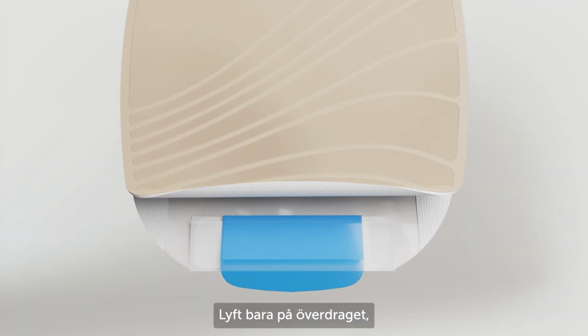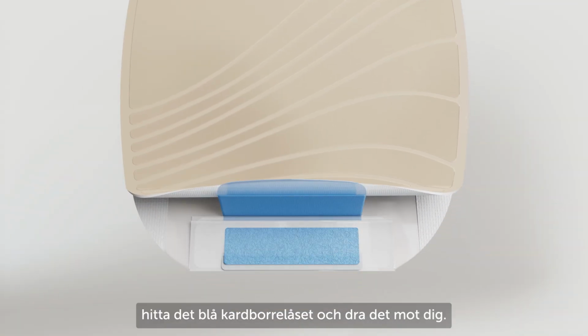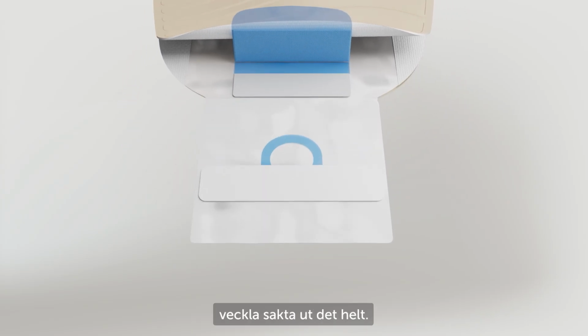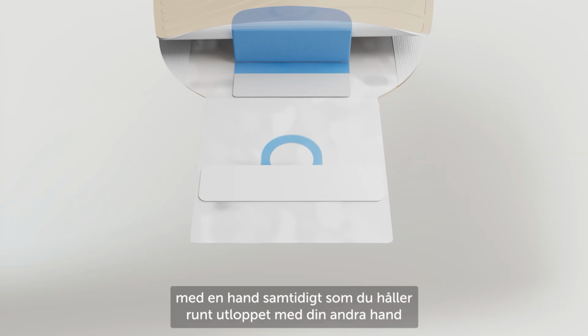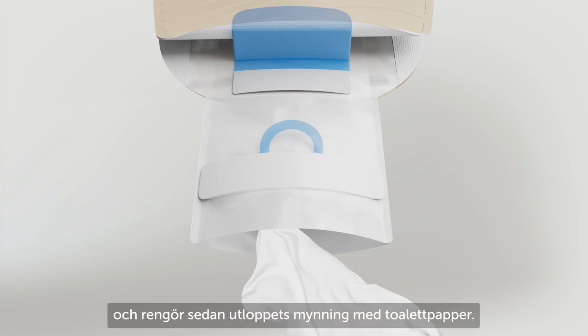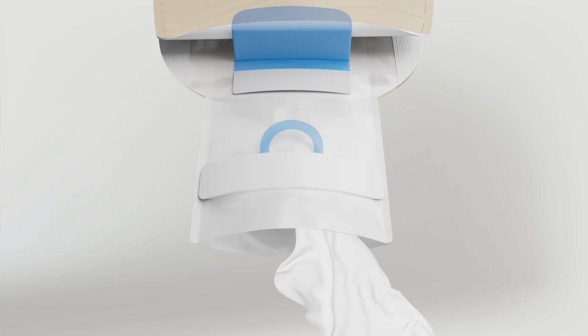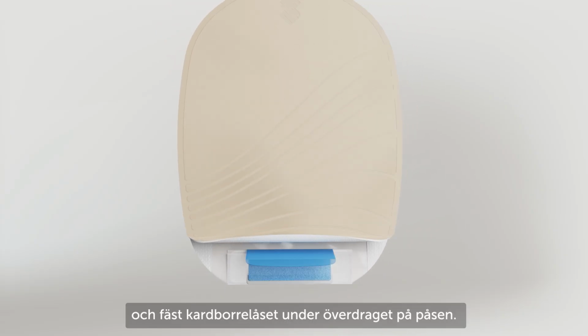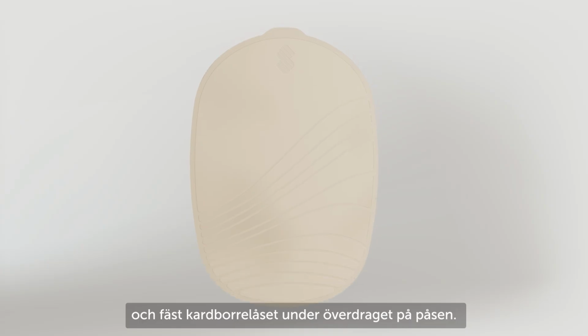Simply lift the cover, find the blue hook and pull it upwards. Hold the outlet at the sides and slowly roll it down until completely unfolded. Hold the blue ring pull tab with one hand and either side of the outlet with your other hand and pull the ring tab. Allow the contents to empty and then clean inside the opening with a tissue. Fold the outlet back up again and secure the Velcro hook underneath the cover of the bag.